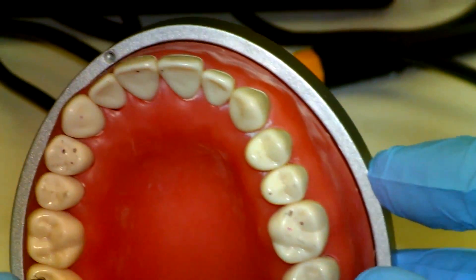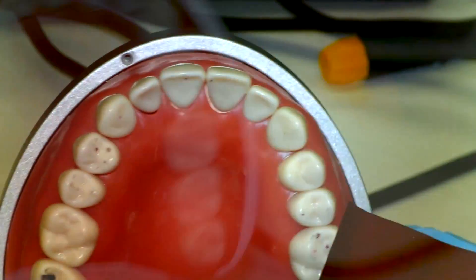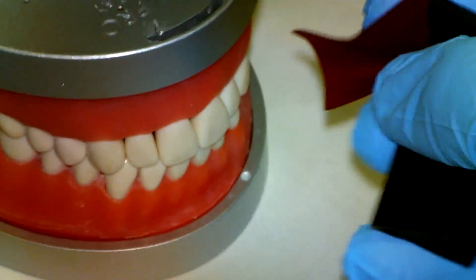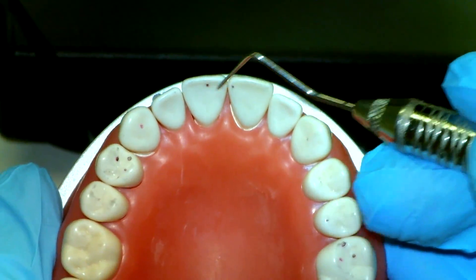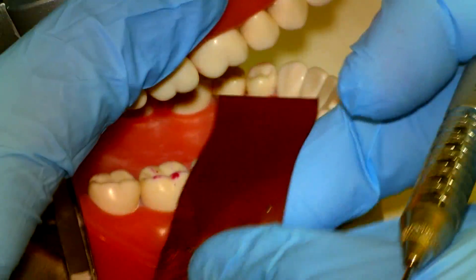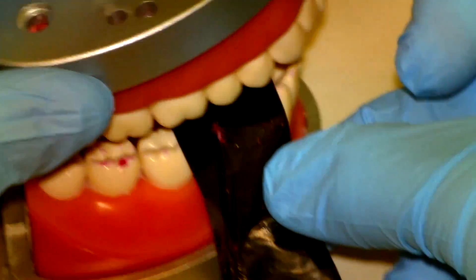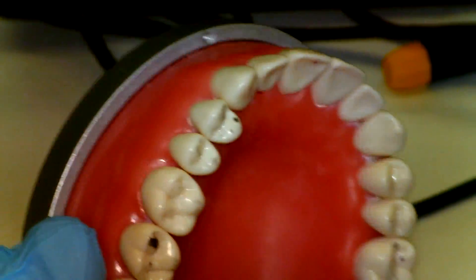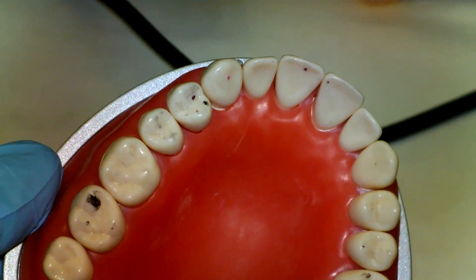Here we see a couple of marks in the anterior. However, when we check with the articulating paper the paper just slides through. Sometimes you get false marks if you slam the articulator a little too tight. In this situation we're going to leave these alone — we're not going to adjust them. Use the paper as a guide to see where your heaviest marks are. When we start adjusting, we want to selectively grind only areas that actually hold the paper and be careful of false markings.